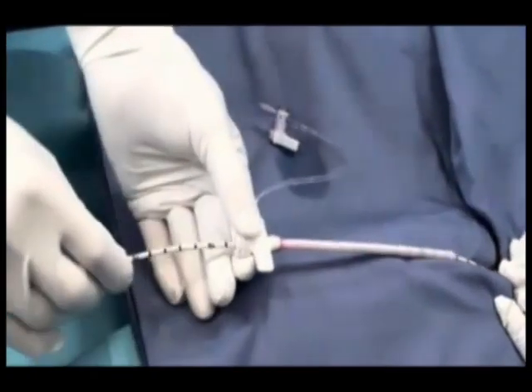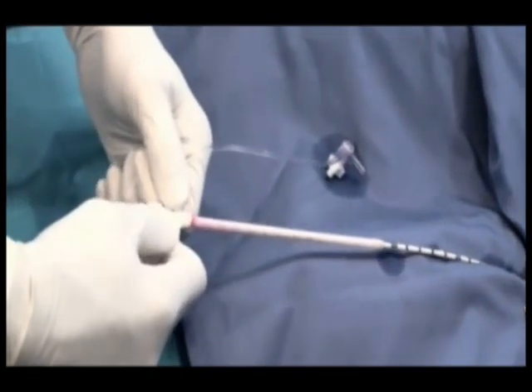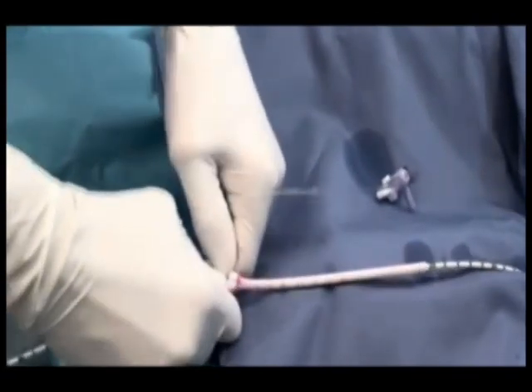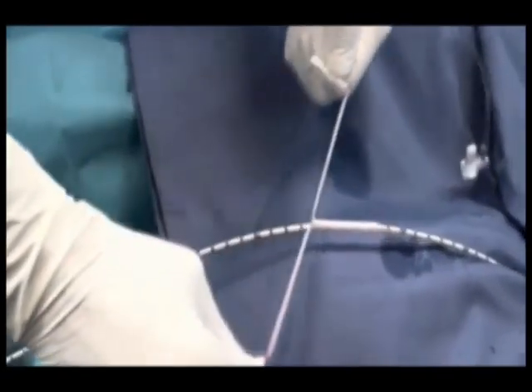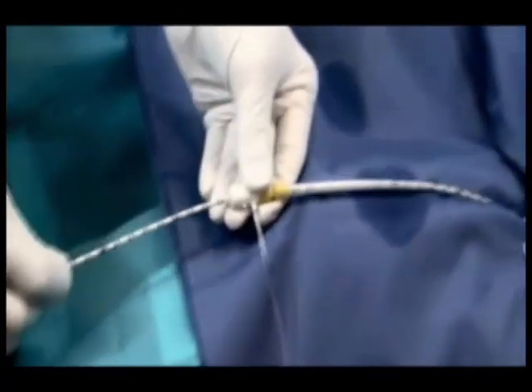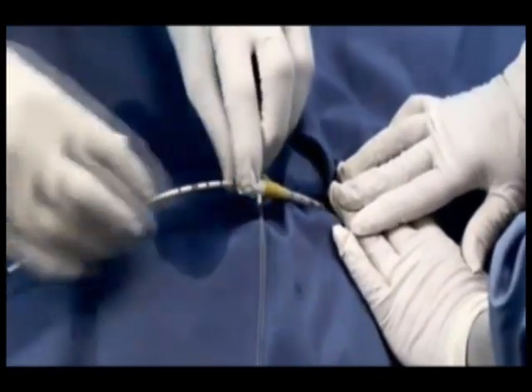After the 13 French introducer is removed from the artery, grasp the 2 wings and bend back until the valve assembly comes apart. Continue to peel the 2 wings until the introducer is completely separated from the catheter shaft. Slide the repositioning introducer over the catheter shaft and advance it into the artery to the yellow eyelet.